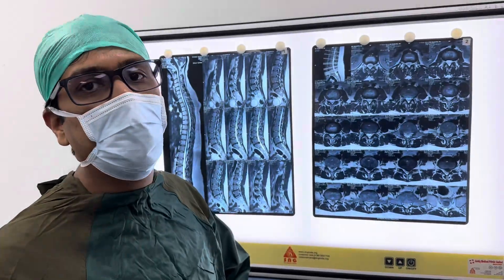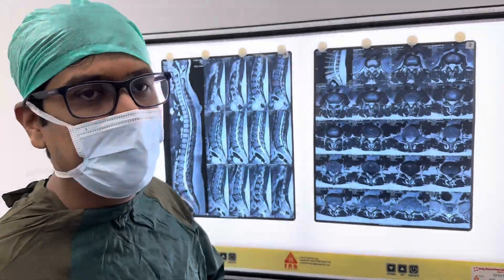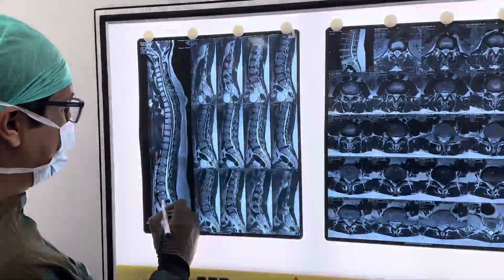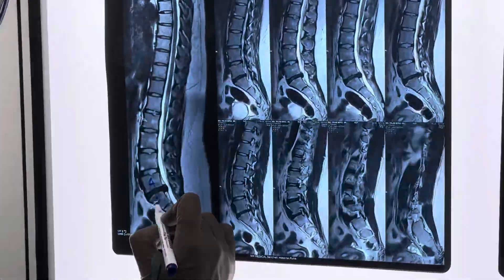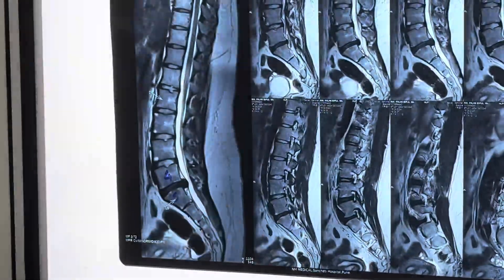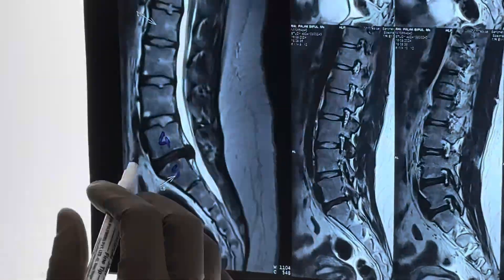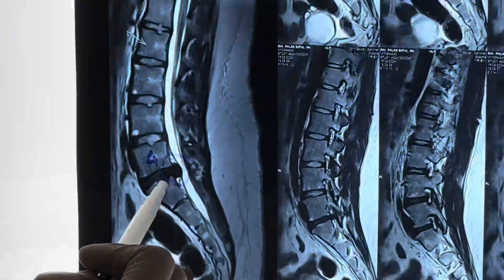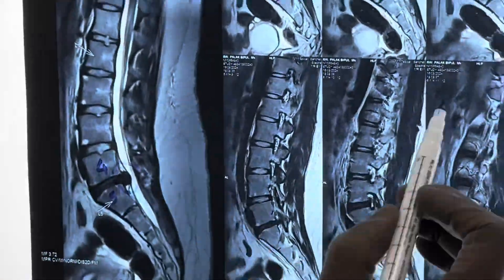We will show you how we do endoscopic spine surgery. This is the OT environment and here you can see this is a young girl with L4-5 disc prolapse. The disc has come out and it is hitting upon the L5 nerve root which is supplying the left lower limb.